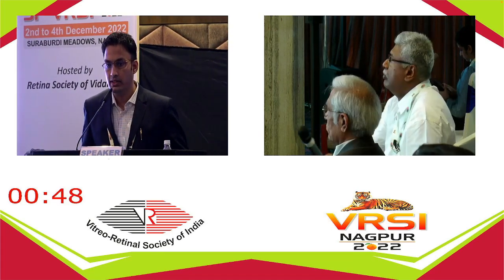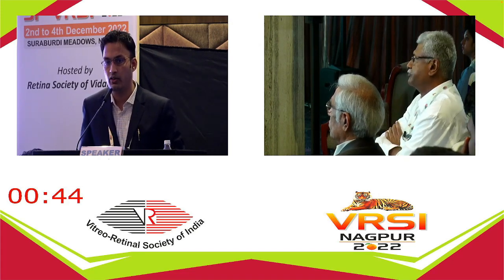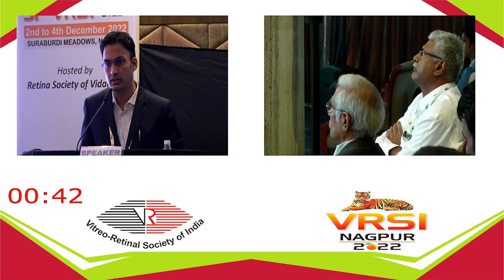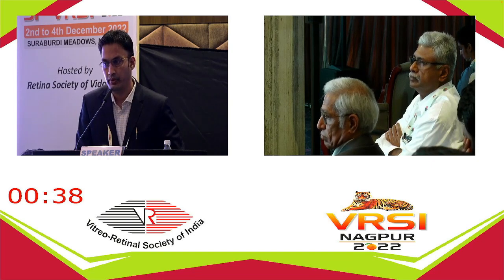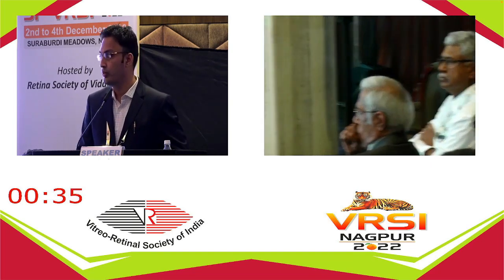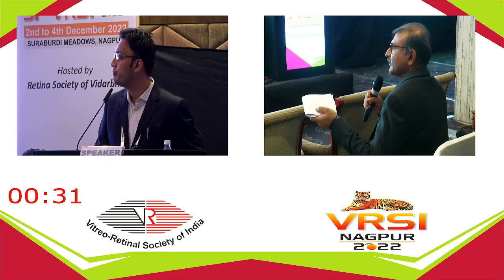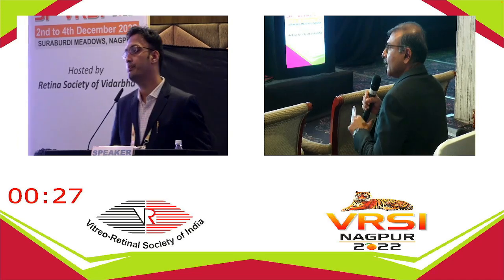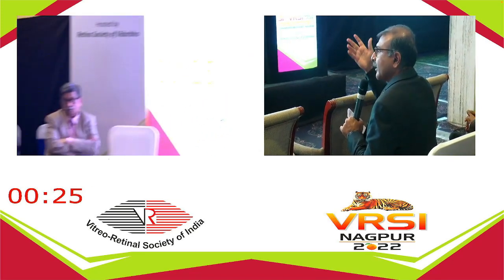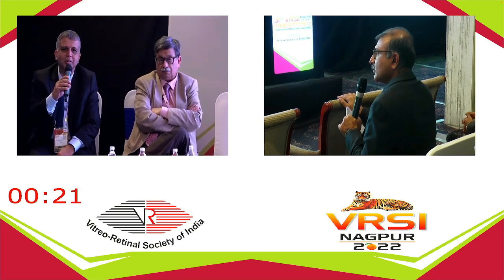Yeah, literature does mention a few cases. Scleral imbrication itself is sufficient to tackle the complex, but none for pediatric retina. So this is the first time we have tried both, just to be on the safer side. Just another point, Tapas, about which you had raised the issue of what happens as the child grows up. Are there any changes you see in the child's eye after it's been imbricated? Yeah, I don't have any experience with imbrication.